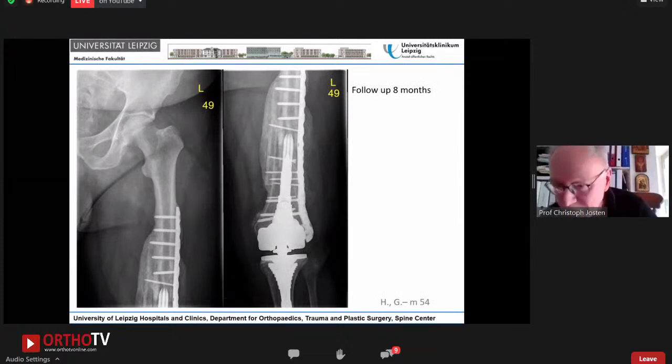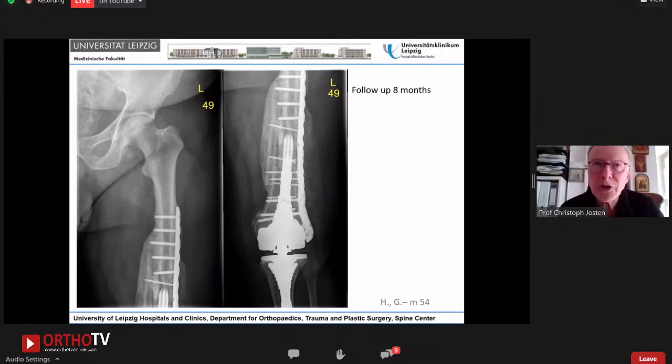But this is a colibri. Not today. We are using it quite routinely, but it's only preserved for certain kinds of cases where we have to do re-osteosynthesis. Strut graft is never an option in primary periprosthetic fractures. So this was a case just for discussion.